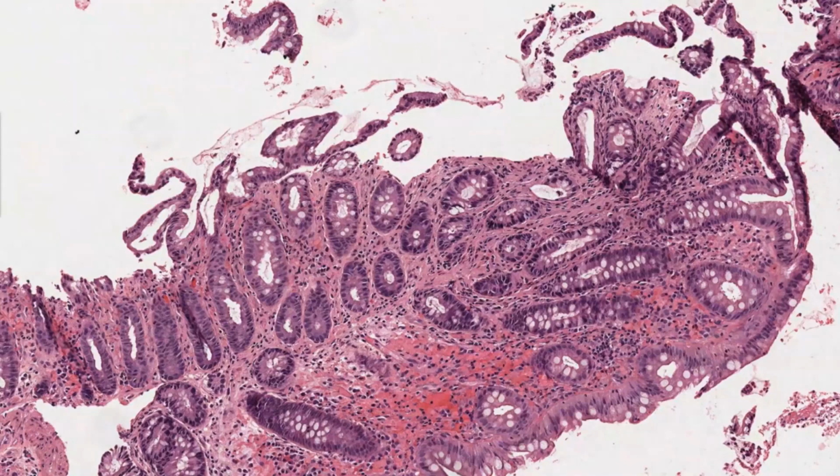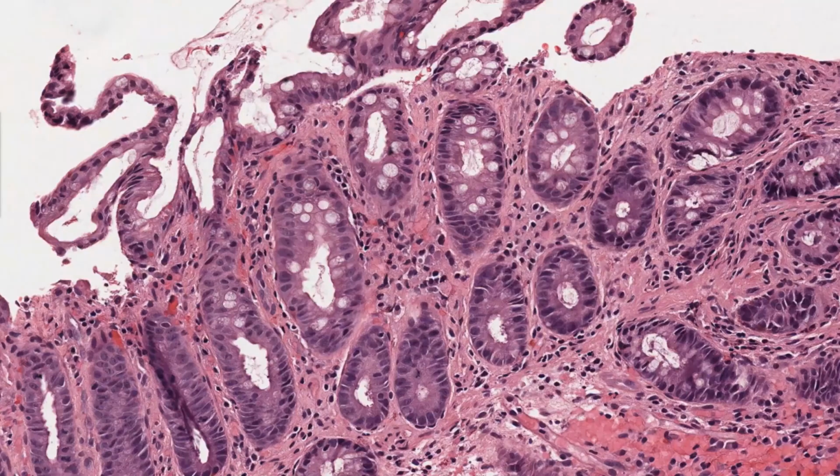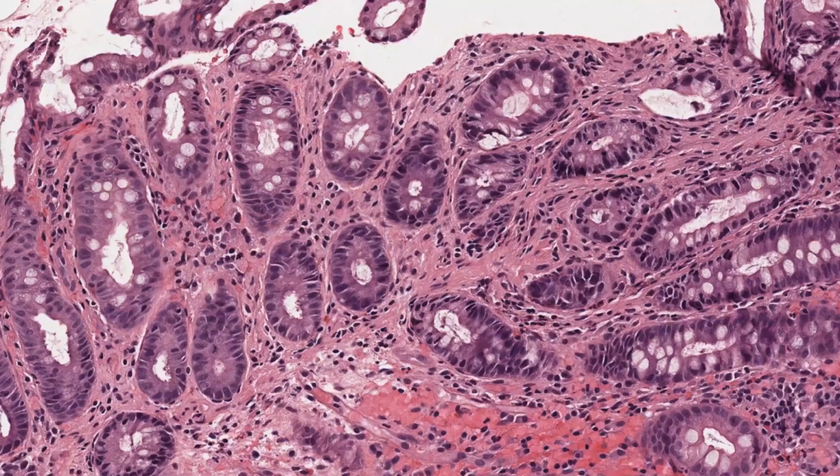We will keep looking, and this is just another close-up on the mucosa to show you that the lamina propria is definitely pinker than what you want it to be. And this is quite important. In terms of the crypts themselves, they are not architecturally distorted in a big way.